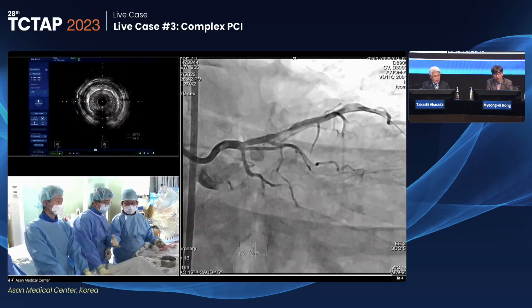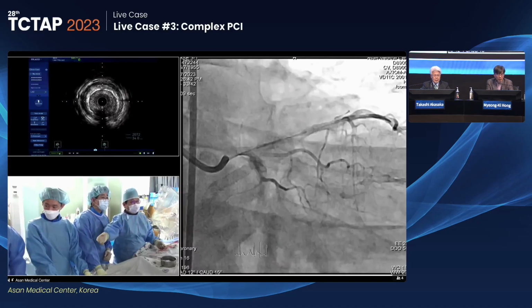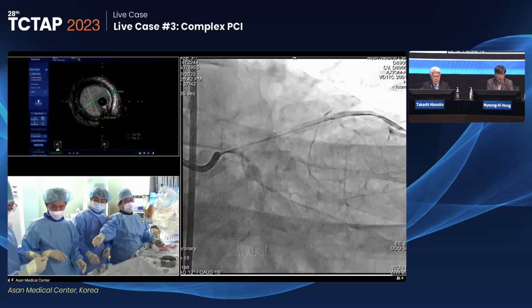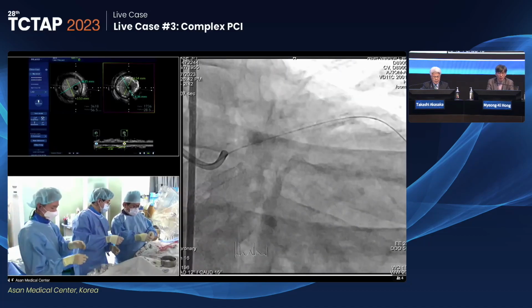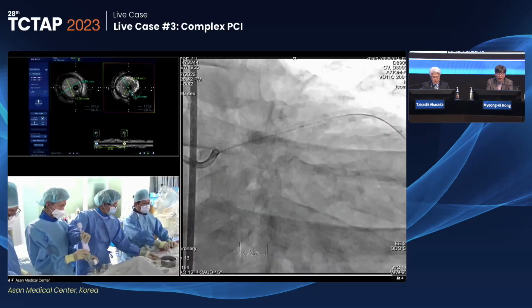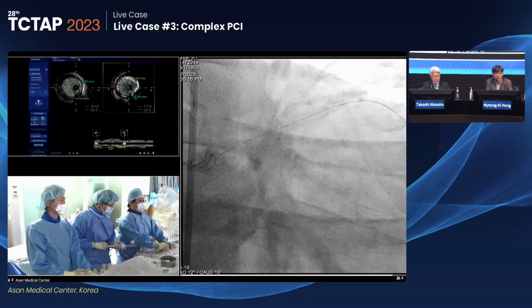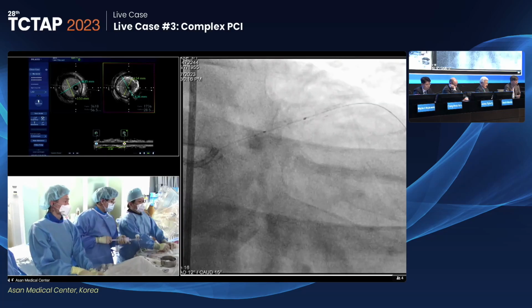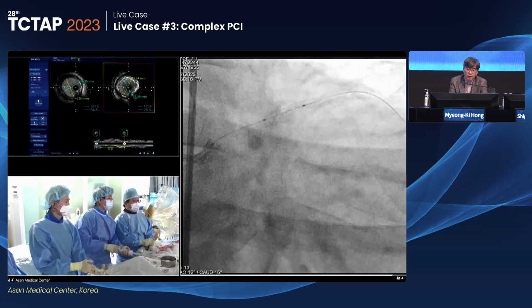Okay. What is the balloon size and the stent size? The left main vessel is more than 4.0. So left main is 4.0, and proximal LAD is also 4.0. So the high pressure balloon for pre-lesion modification is 4.0 by 20, a non-compliance balloon. In the in-stent stenotic region with atherosclerosis, there is more possibility of some slow flow or no reflow after the balloon dilation. Inflation, yes.